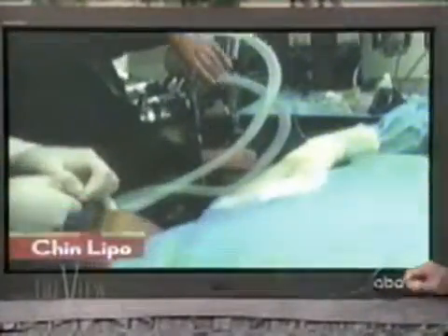This is iodine being placed to sterilize the area. The liposuction is done through a very small incision. She's out, right? She's asleep. She's asleep. That's the anesthesiologist. And mostly there's fluid. This is the part you might not want to see. And the dressing's put on afterwards.